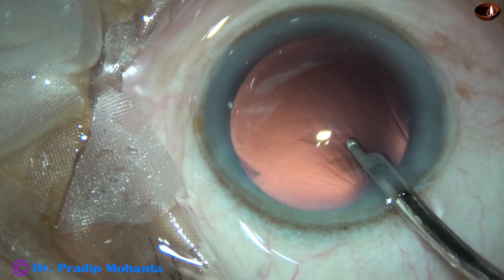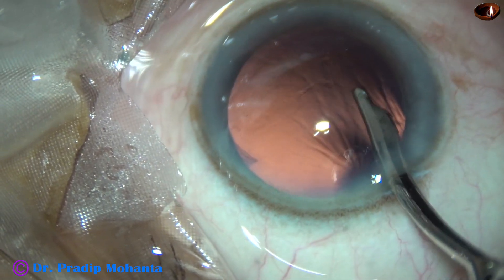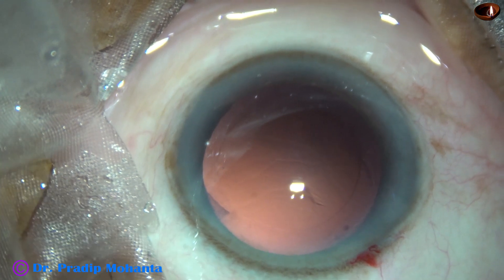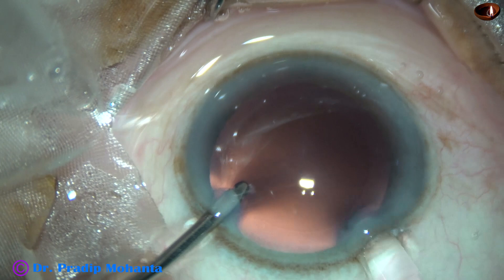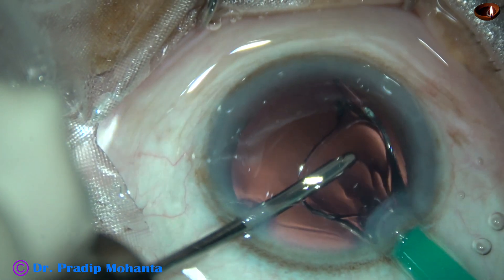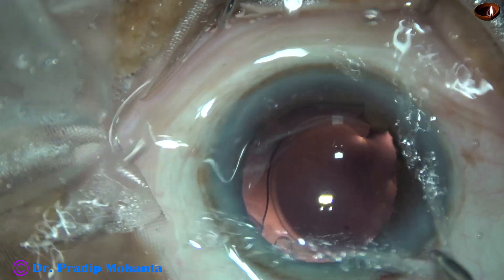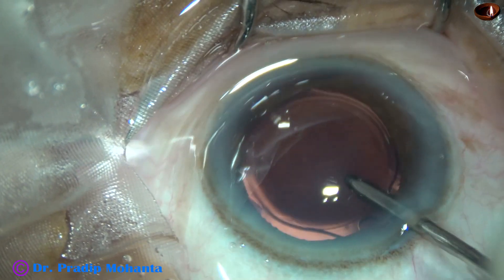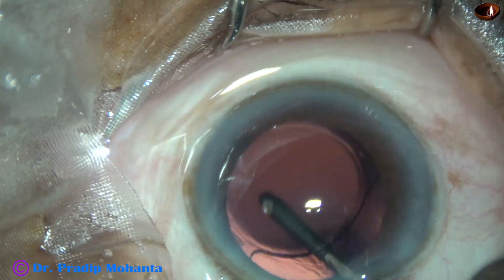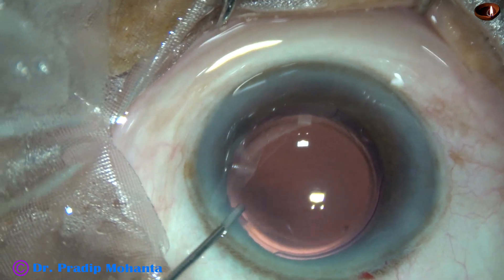We have only one side port, and the width of this side port is about 1.6 mm. This is a 23-gauge Simcoe cannula. A little bit of polishing of the posterior capsule is done. A hydrophilic acrylic single-piece monofocal intraocular lens is being implanted, keeping the anterior chamber formed by irrigating fluid. The trailing haptic and then the leading haptic have gone into the capsular bag. The lens was actually above the anterior capsular rim initially, and it has been placed in the capsular bag by the irrigating probe itself — I didn't use any Simcoe.